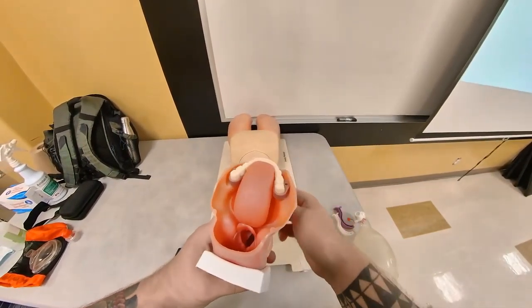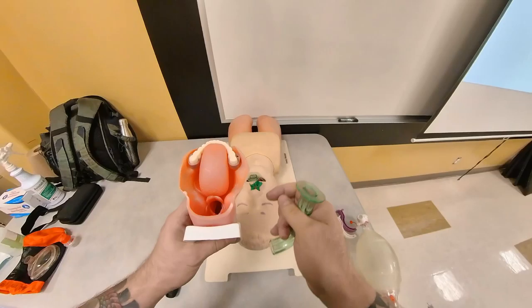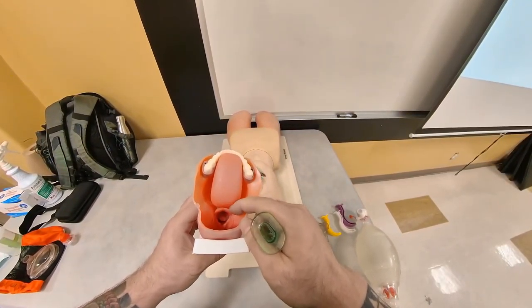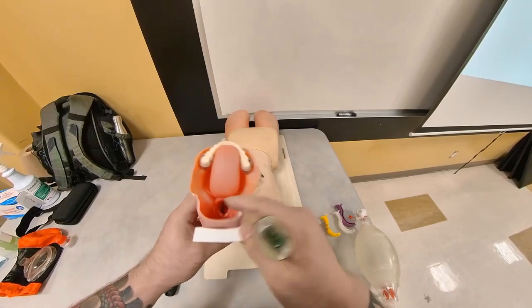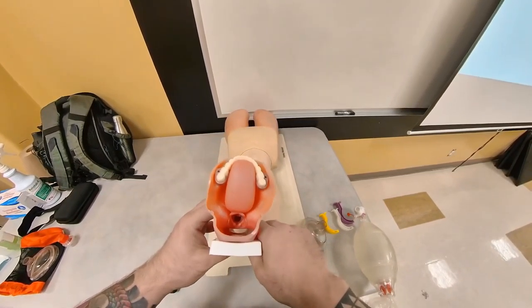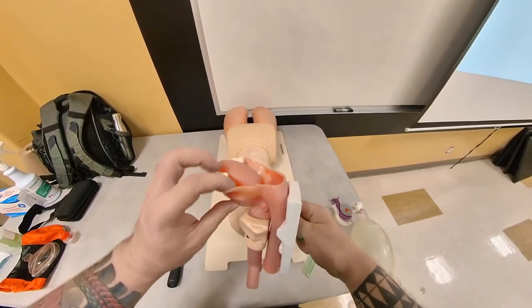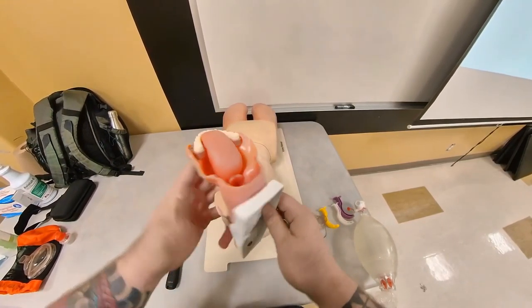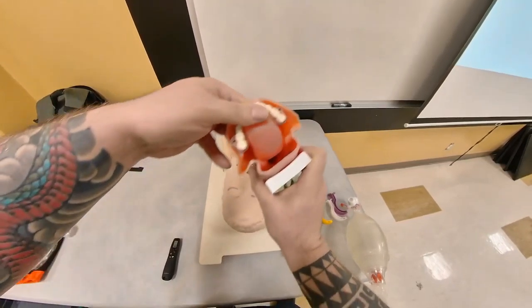If you look at this mannequin cutout, all these mannequins are made with a fixed tongue in an open position so it doesn't occlude the laryngeal inlet. However, on a person who is unconscious, this muscle — the genioglossus muscle, which is attached to the mandible, the lower jaw — it relaxes and is going to fall back.